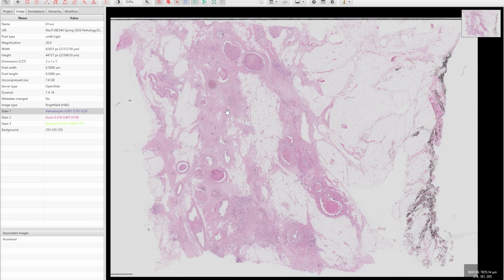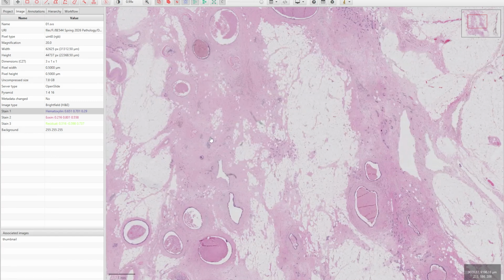So we need to learn how to annotate a specific region or specific regions so that we have the annotations, we have the coordinates of each of them, and using Python or any scripting language, we can extract those images or those ROIs and work on them.